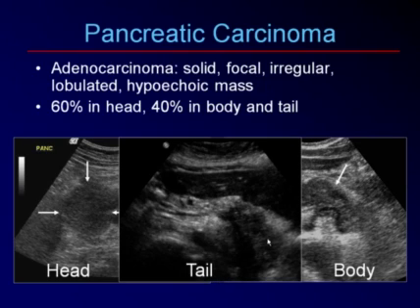Here's a patient with a pancreas, and as we were imaging down the tail, we noticed a hypoechoic, lobulated, irregular mass, extensive down the tail.